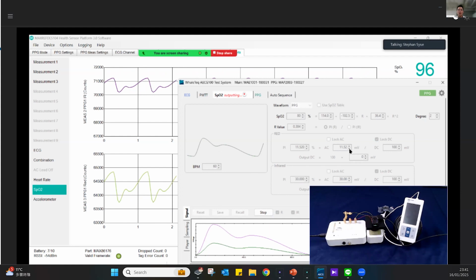What I'm doing here is what you might be doing on the golden sample of your wearable device manufactured in a batch. You pick a golden sample from a batch, let's say 50, run the SpO2 table to get the reference R curve over here, and then use it to check the performance at each level. This is called repeatability.